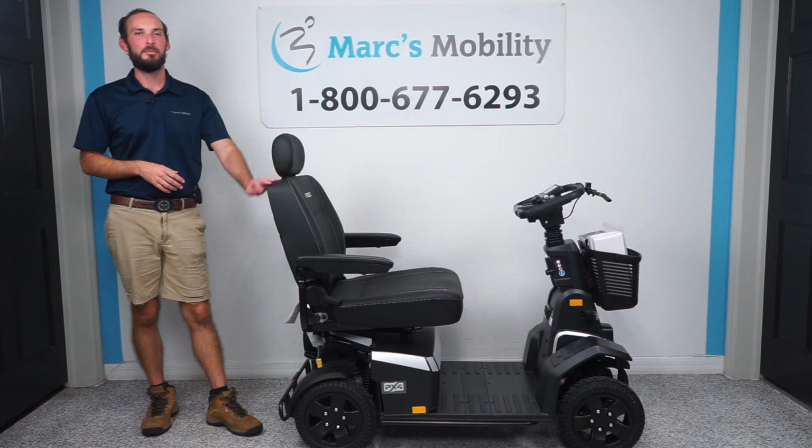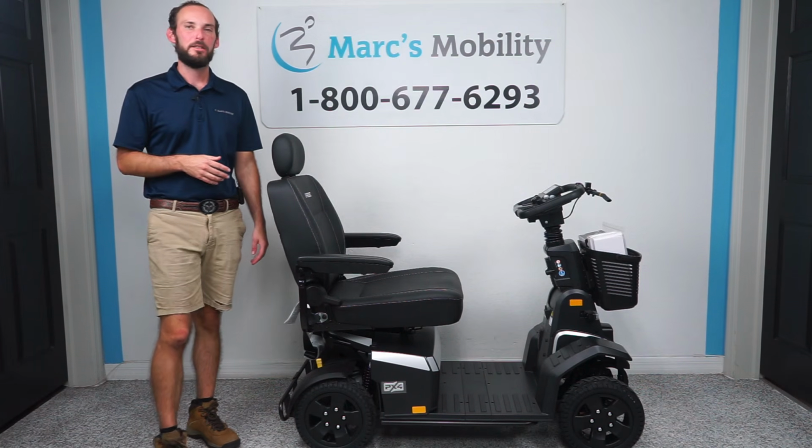Today I'm going to show you how to change the batteries in the PX4 by Pride Mobility, so stay tuned.